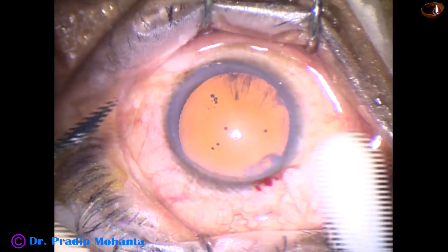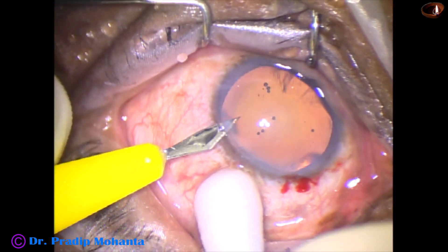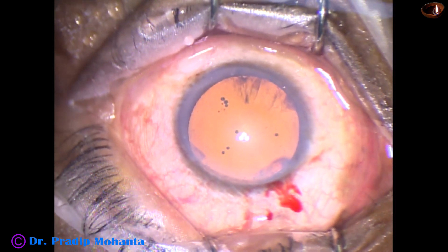By this time, the main incision has been made, and this is the side port on the left side of the main incision, about 3 o'clock hours away.